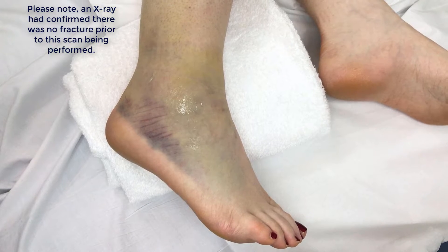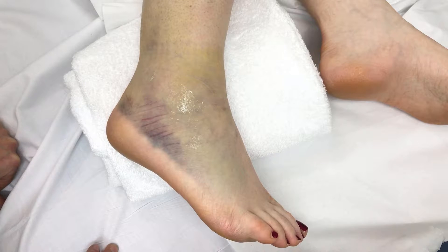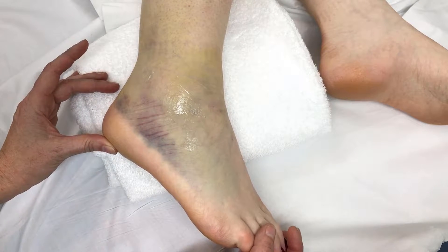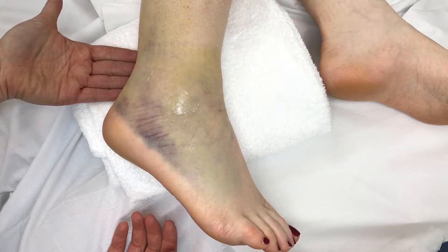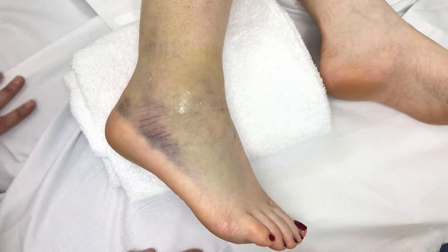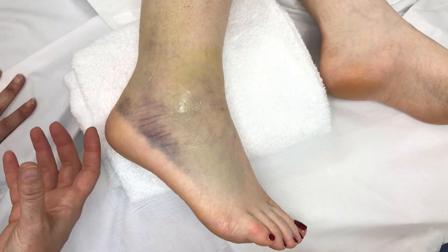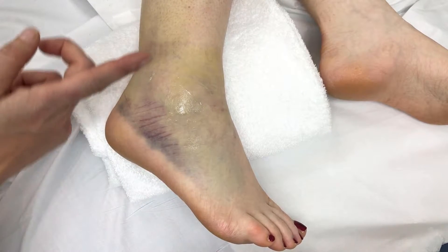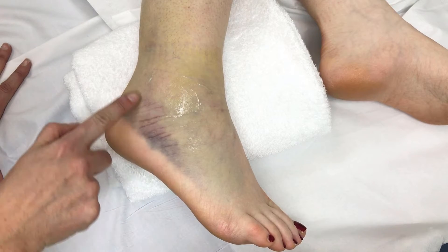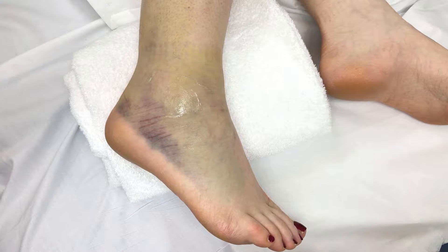The clinical test that goes along with an ATFL injury is the anterior draw test. Some people try to perform the anterior draw test while scanning, but it works really well to just plantar flex the foot and make sure the instep or medial malleolus is propped up with a large towel to allow free ankle movement. You'll need to compare with the other foot, so make sure both shoes and socks are off. Start with the lateral ligament complex — beginning with the syndesmosis for a high ankle sprain, then the lateral ligament complex, then the midfoot, then roll the patient and do the medial malleolar ligaments.